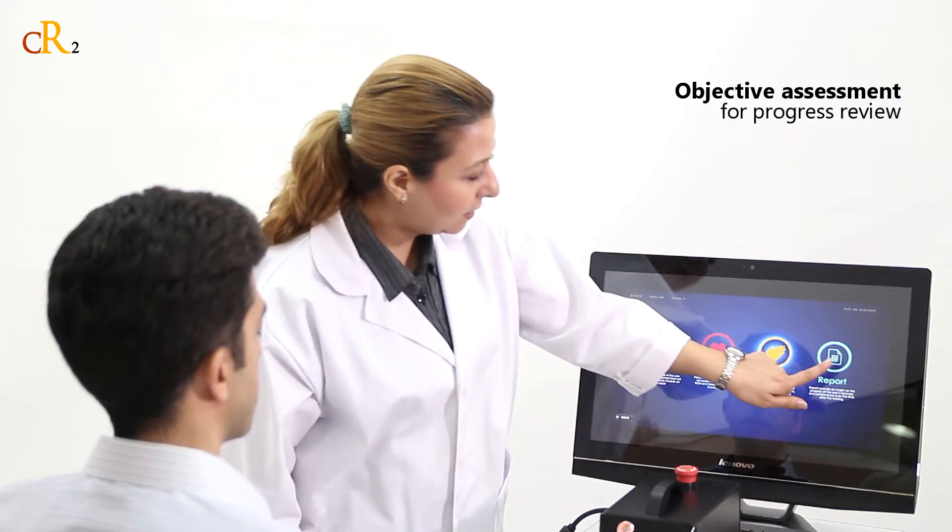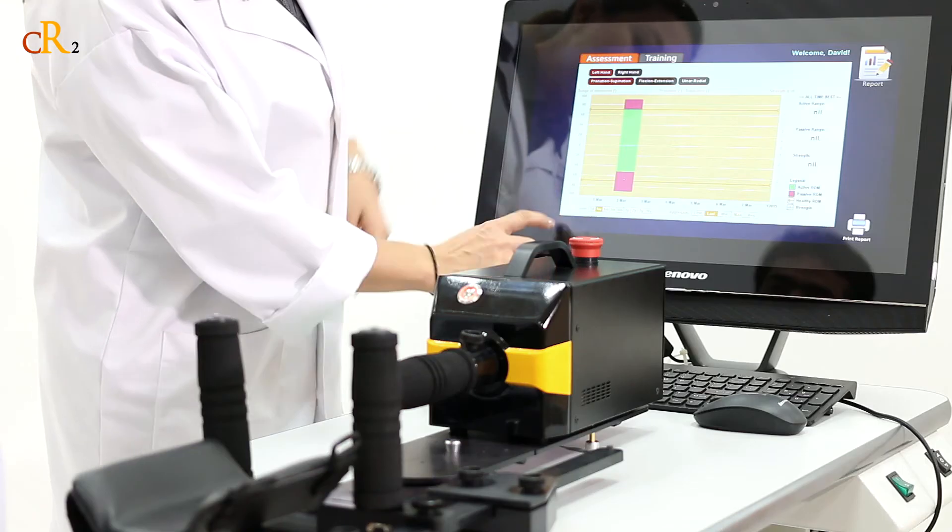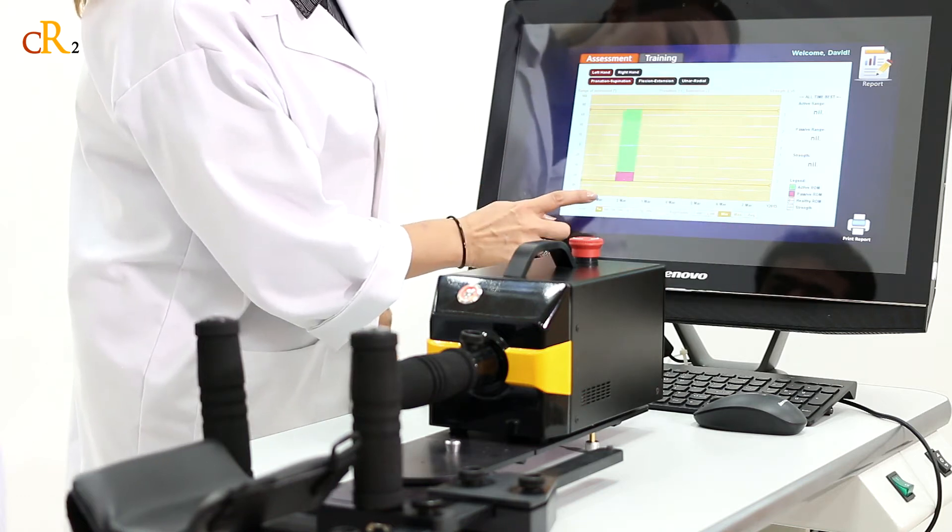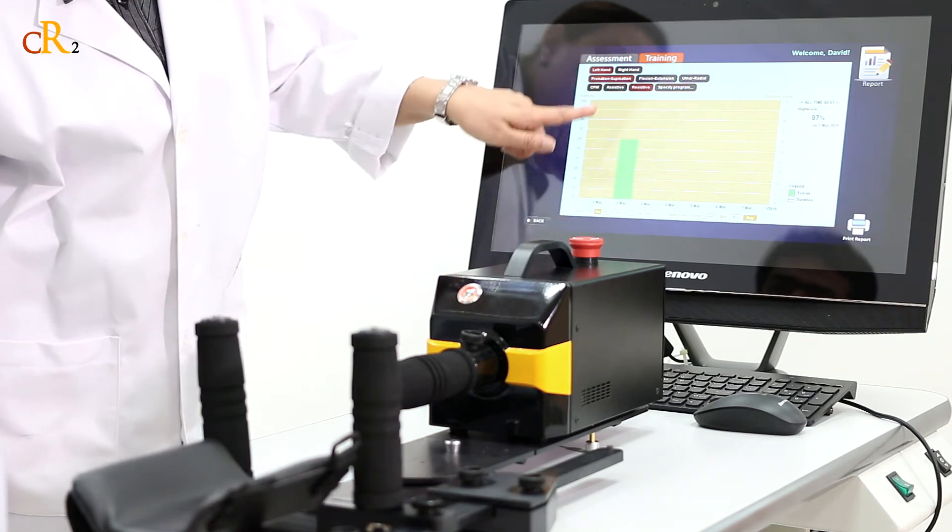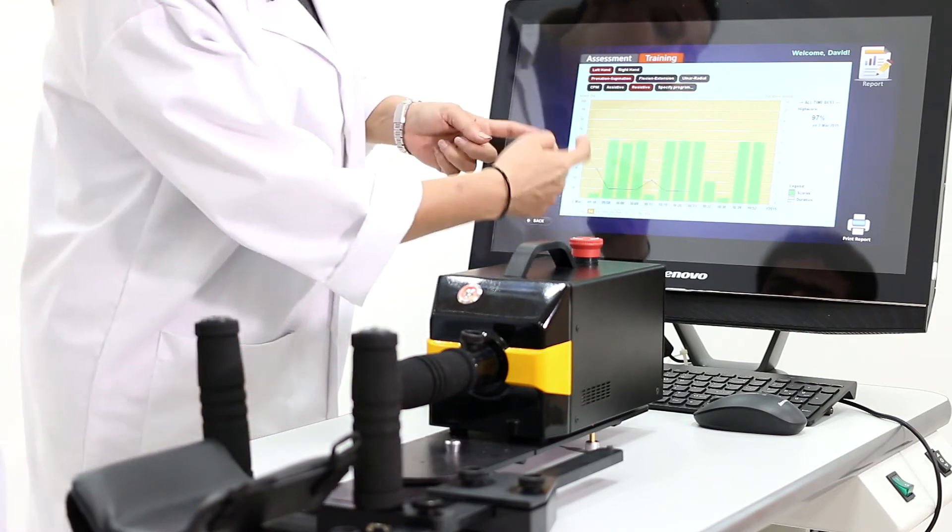The robot also provides an assessment program for evaluating hand movement in terms of movement range, strength level, and gain performance, which can be used in the therapy assessment process. The assessment results are recorded in a report, enabling users to review their progress over time.